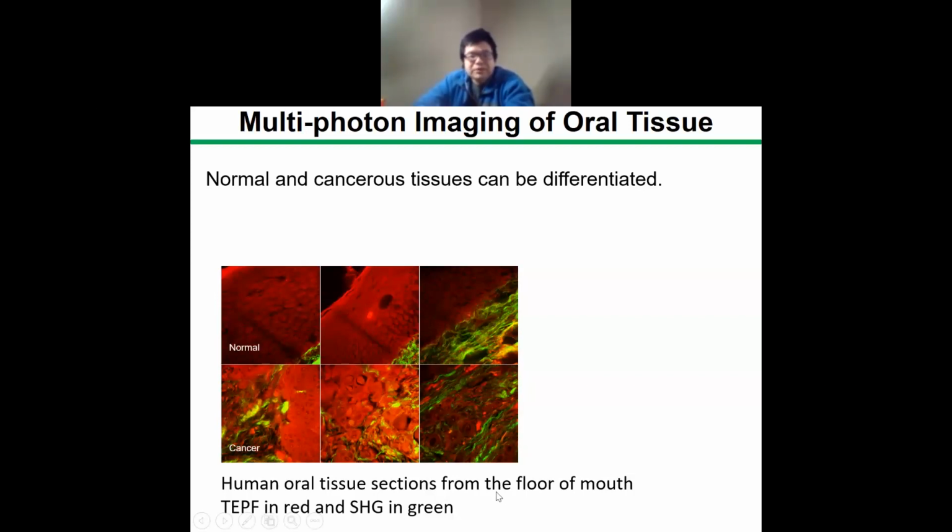Another challenge is how you move to the clinics. What kind of application should we validate at the beginning? We chose human oral cancer, which builds on the work we already did with Professor Eben Rosenthal at Stanford. Here we also have very good facilities for large and small animals. For example, canine, which is a dog, so you can image the oral cavity.